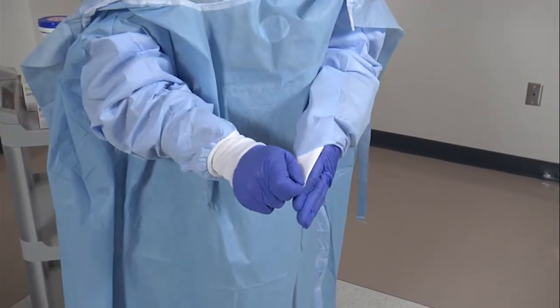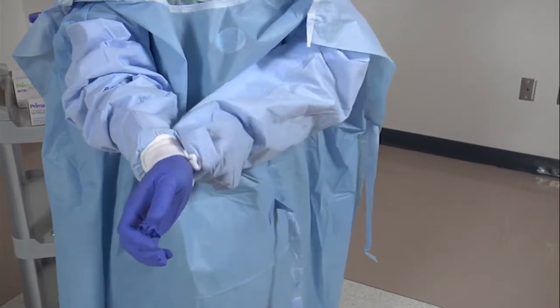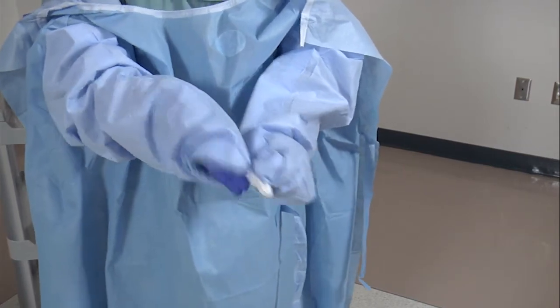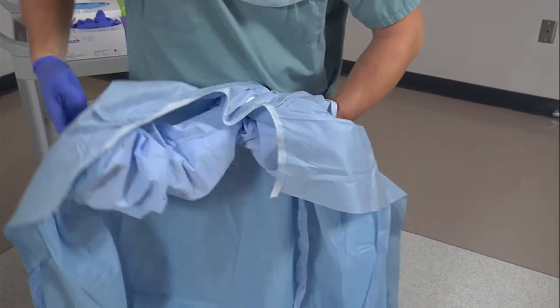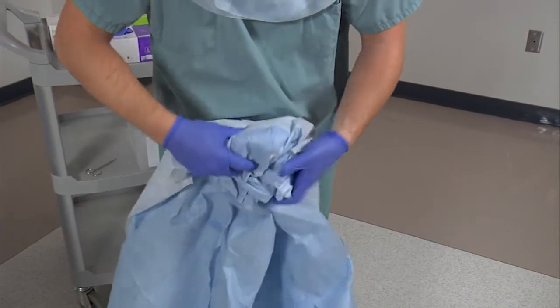Slide two fingers under the cuff of your gown and pull your hand into the gown. Using the hand that is covered, grab the outside sleeve of the gown and pull away from your body over your hand. Continue folding the gown inward onto itself and roll it away from you until it becomes small enough to discard.